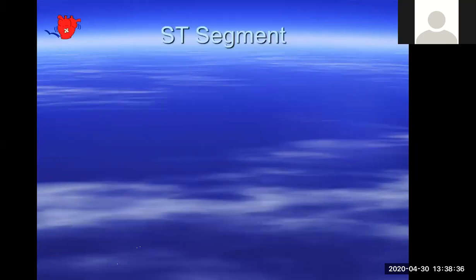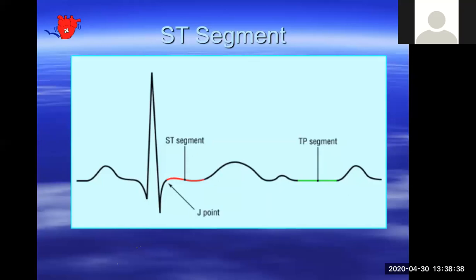Okay, let's talk about the ST segment. The ST segment is the segment between the end of the S wave and the beginning of the T wave. The junction of the S wave to the ST segment is called the J point. You have to look at that. The importance of the ST segment is its level. It's not the duration, but the level.